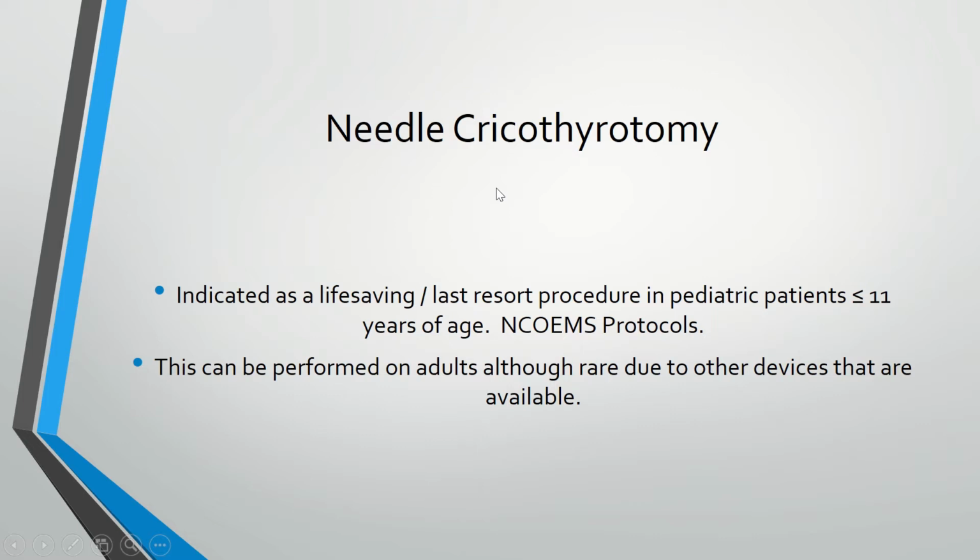Like I said, it's indicated as a life-saving last resort procedure in pediatric patients 11 years old or less. That is straight out of the NCOEMS protocols. It can also be performed on adults, although rare, because we have other devices available, whether you're doing a surgical cric or any of the pre-made devices that are out there nowadays.